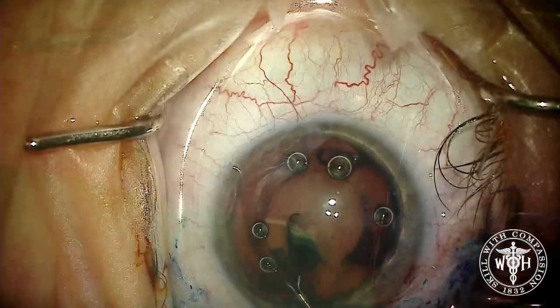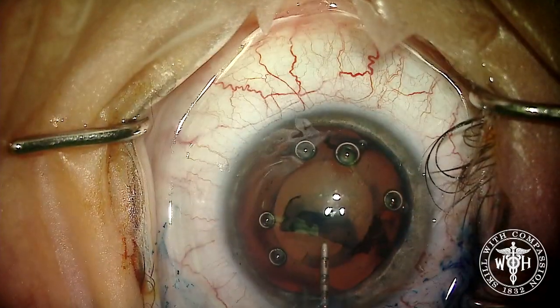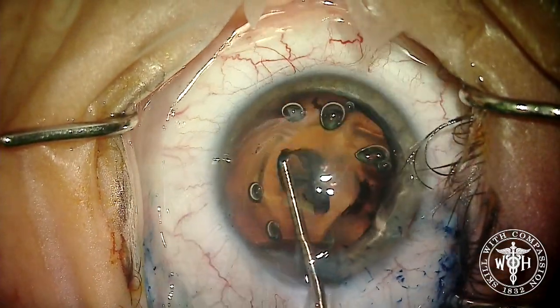We're using Vision Blue to carefully stain the capsule and making sure we get a nice round reflex. Using a micro-utrata and an intraocular ruler to make sure that the capsulorhexis is right about the 5.5 to 6mm mark.